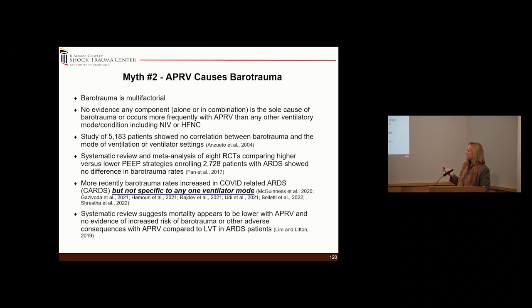Systematic reviews and meta-analyses have shown that there is no difference in barotrauma rates when looking at any modes compared to APRV. More recently in COVID, the actual rate of barotrauma increased, but it was not specific to any ventilator mode. And actually, a systematic review suggests that mortality appears to be lower with APRV and no evidence of risk of barotrauma or adverse events when compared to low tidal volume in these studies.